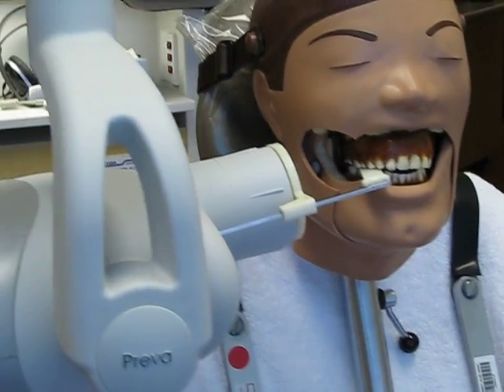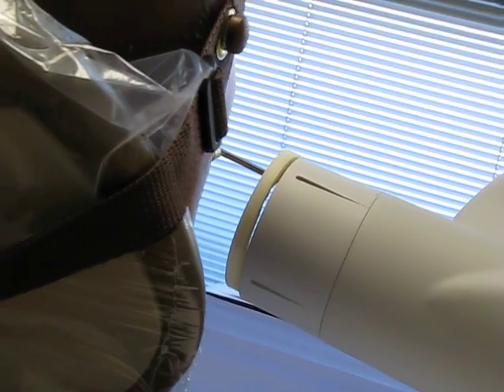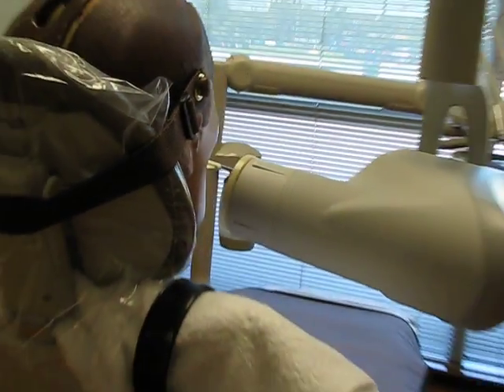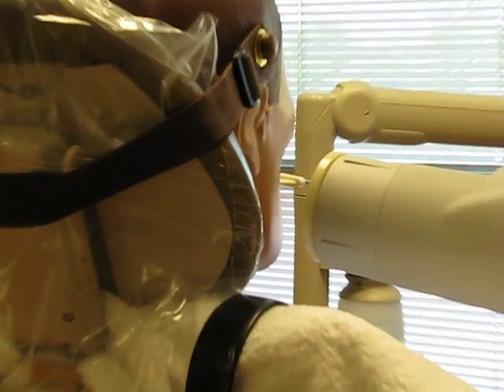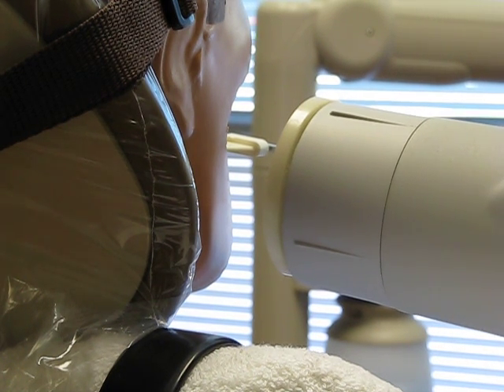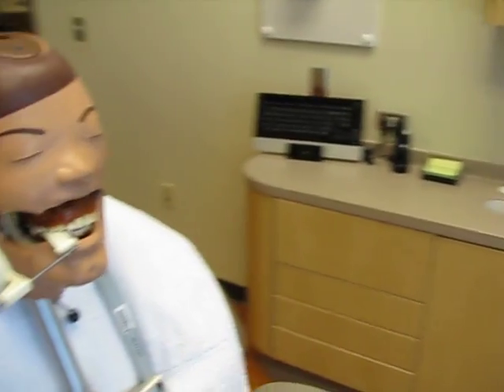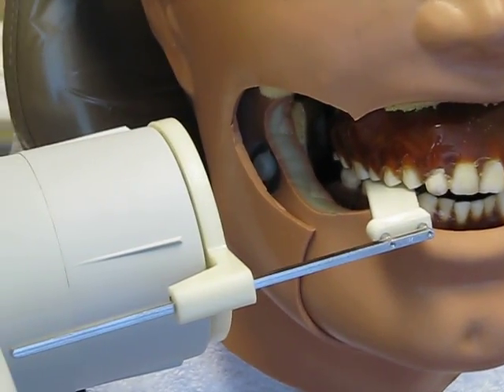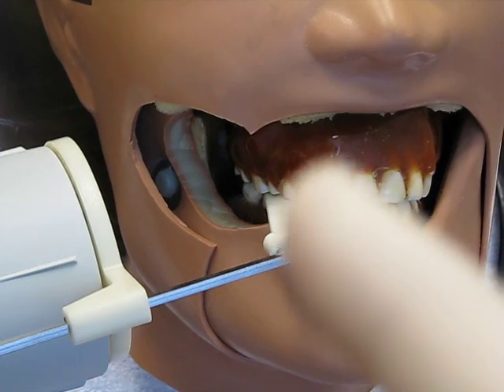Okay? And having the ring that close to the cone is called flushing it. I have it flushed against the cone. Bring you over on this side so you can see that it's equal distance. Okay? If it's open just a tad bit, then we'll adjust it a little bit, and I'll give you a different view from this side and see if I can close it just a tad bit. There you go. So it's equal distance from this side. Let's bring you over to this side so you can see. Parallel the cone and the line, the ring to the cone, and the teeth.